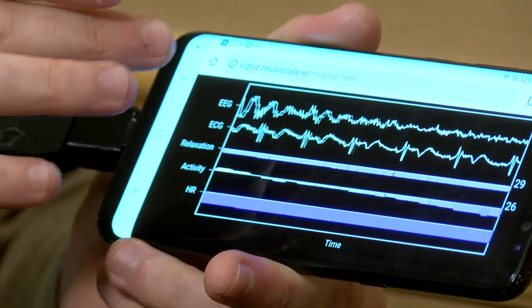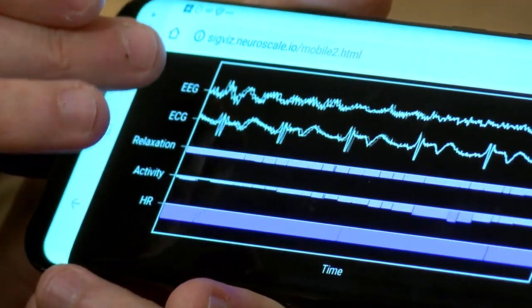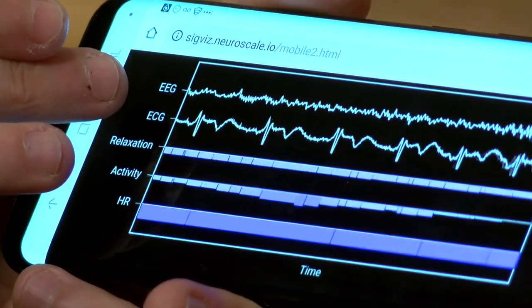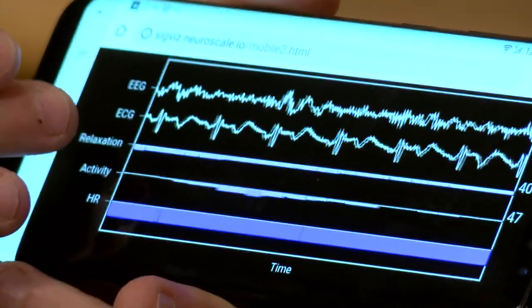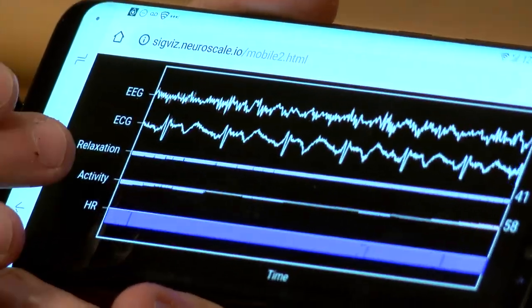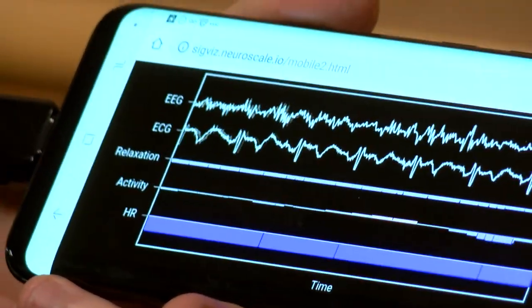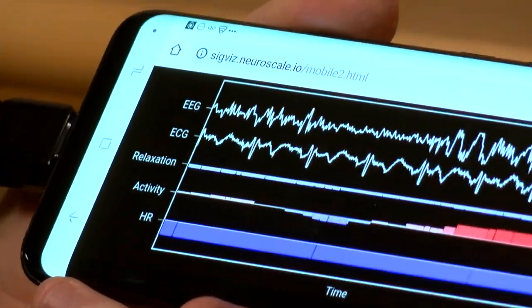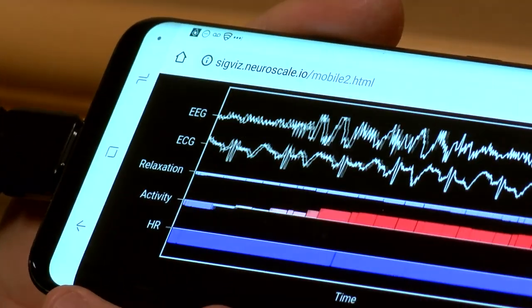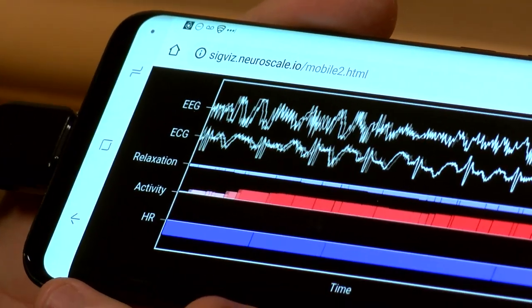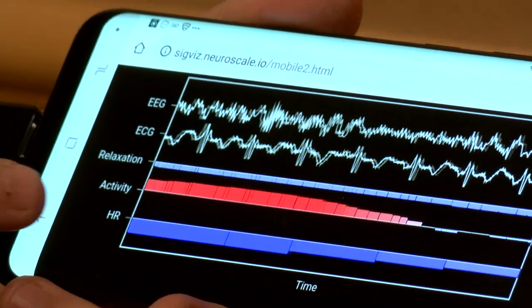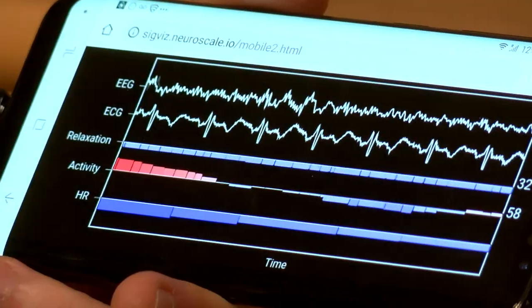All that happens in the cloud and comes back to my mobile device. So we've got our EEG, our ECG, our heart activity, my relaxation score, and actigraphy — so if I move around a little bit it's going to go up and get all red, and now I'll be still, and then my heart rate.